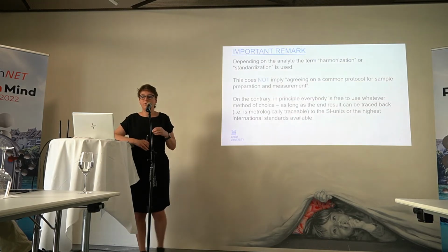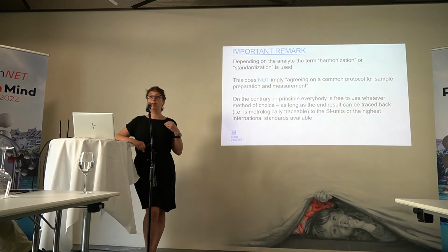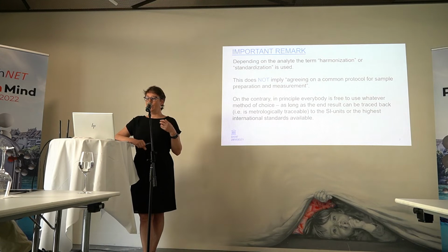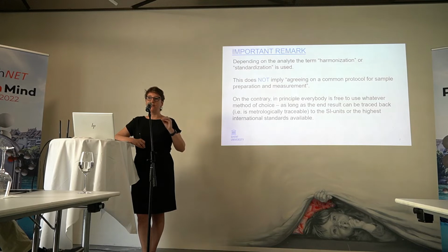A very important remark that I would like to make in the beginning of this presentation is that depending on the analyte, we use the term harmonization or standardization. I will try to explain the difference somewhere along the presentation, because I feel it's more at its place there. But standardization in this way does not mean agreeing on a common protocol for sample preparation and measurement.